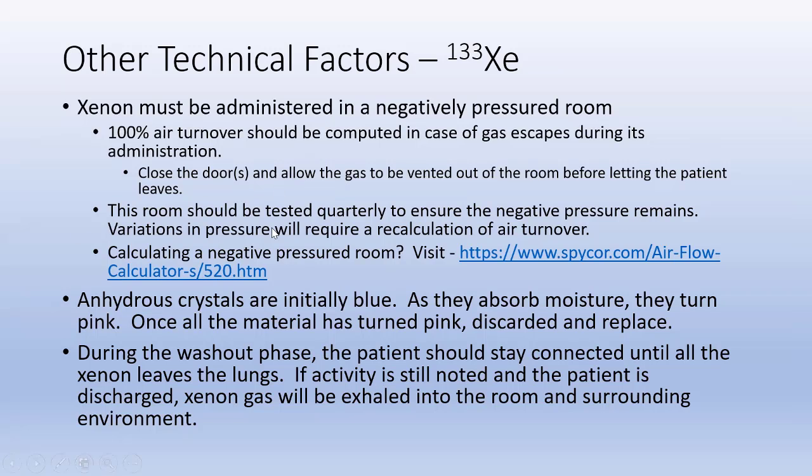Likewise, usually on a quarterly basis, that is 4 times a year, you should actually evaluate the actual input and output of air going into that room so that you can calculate the actual amount of air, how long it takes for that air exchange to occur. If you have those values and numbers, you're more than welcome to click this website right here. It'll give you more of that information. You can actually type in the numbers for the input and the output. It tells you how long the airflow will take to exchange at 100%.